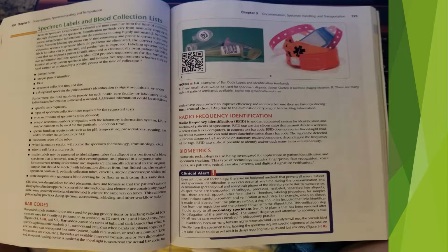Barcodes. Barcoded labels, similar to the ones used for price and grocery items or track and railroad boxcars, are used for identifying patients on an armband, an ID card, etc. In blood specimens, barcodes consist of a series of light and dark bands to relate to the specific alphanumeric symbols, i.e. numbers and letters.